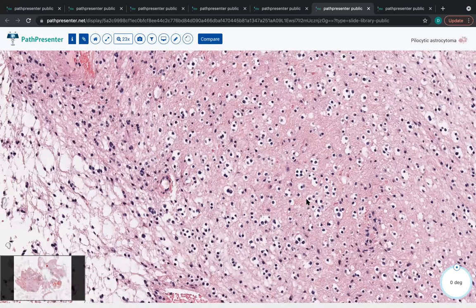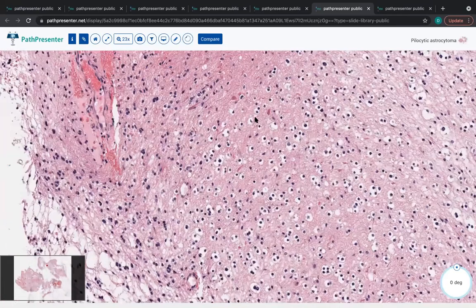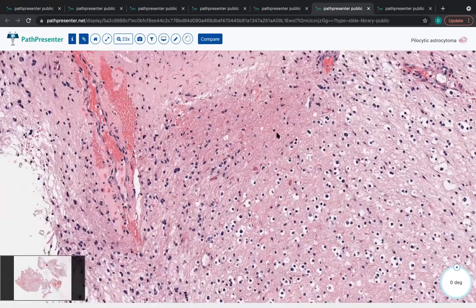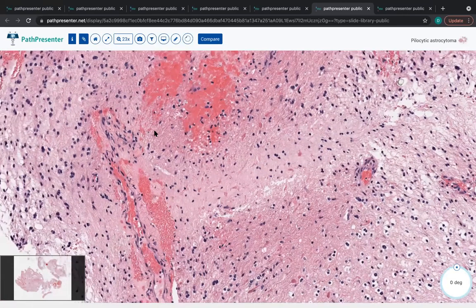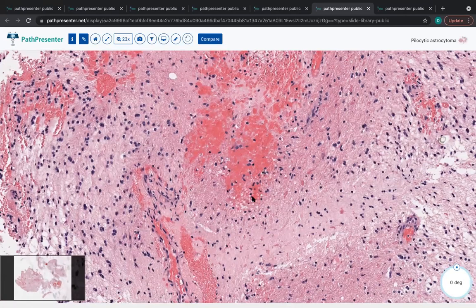Many of them do have this oligodendroglial-like morphology. There's a large amount of morphologic overlap for these entities, and that's part of the reason for revising our practice and trying to avoid labeling any of these tumors without additional molecular testing to provide support. They're just very, very difficult on morphologic grounds alone, especially in a limited biopsy.